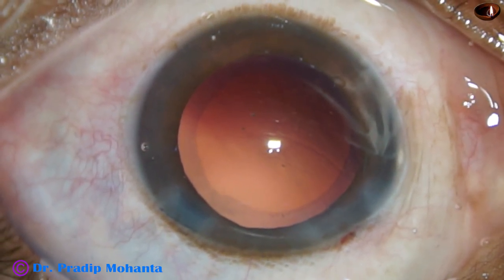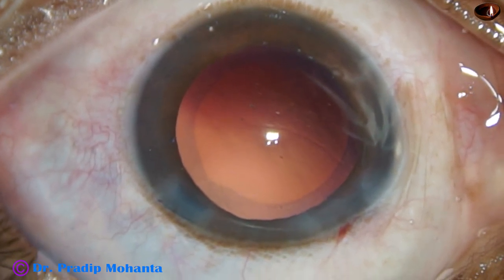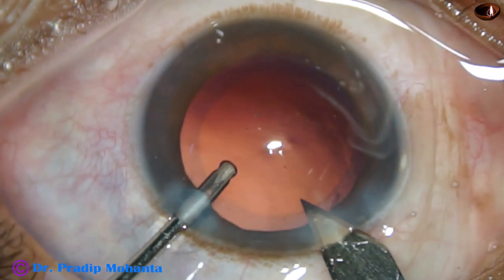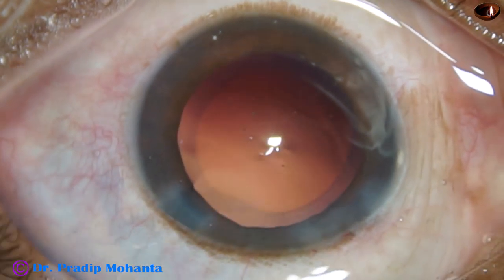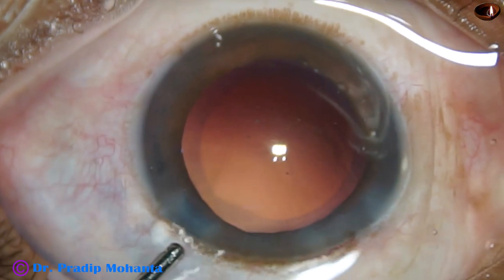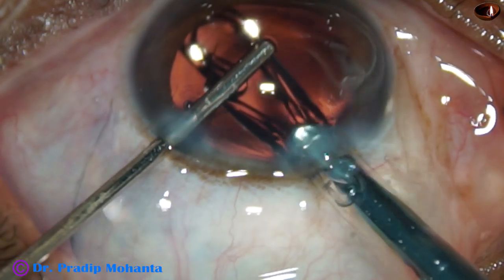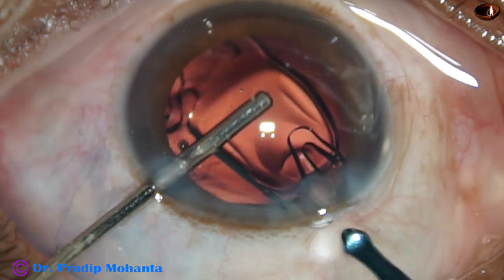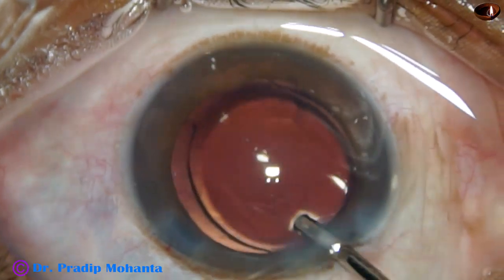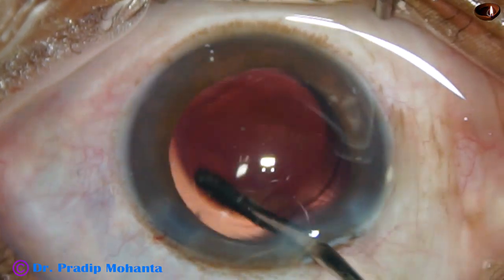Now it is time to implant an intraocular lens. In this case a hydrophilic acrylic single-piece monofocal intraocular lens has been selected, and I am going to use a cartridge injector — I enlarge the main incision a little bit — and this is hydro-implantation of the hydrophilic single-piece intraocular lens. Just by a push of the left-hand instrument the lens goes into the capsular bag, and this is done.